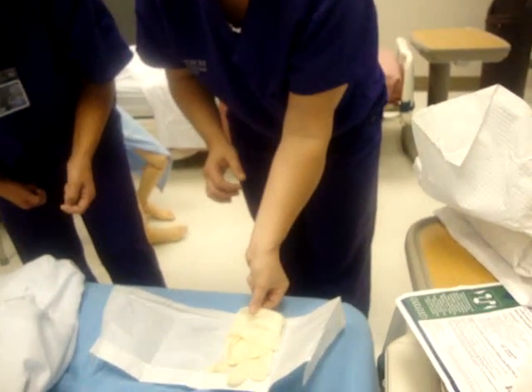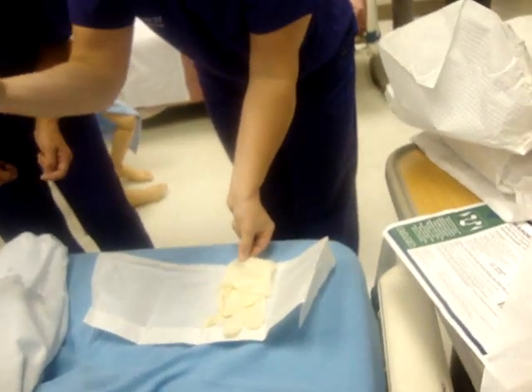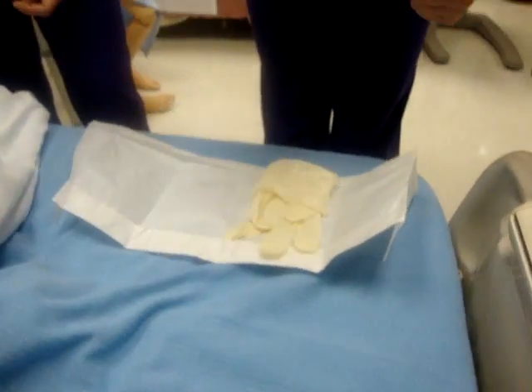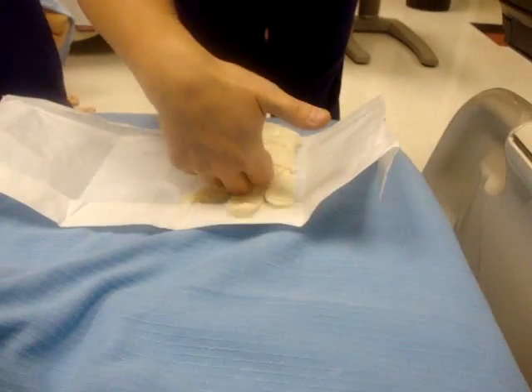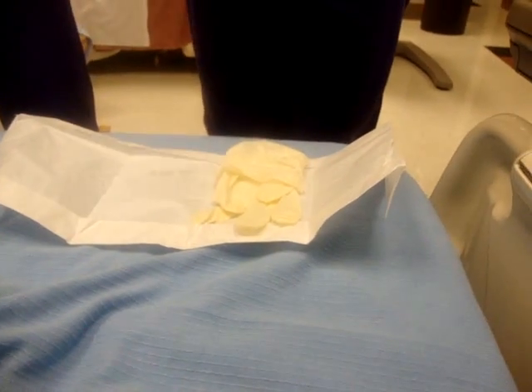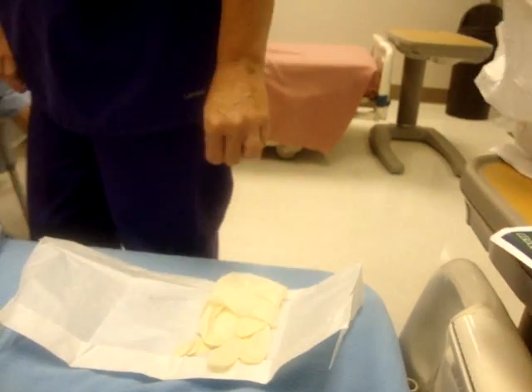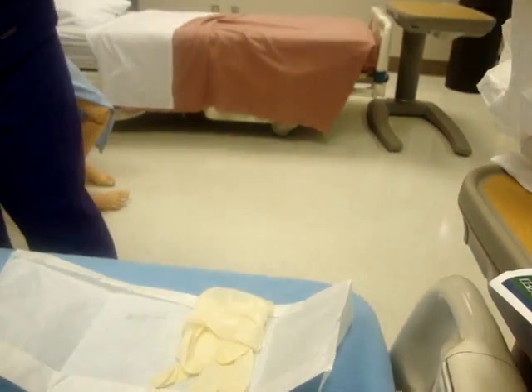This part is going to be against your skin. All right, the second one — now you've got a glove on, you can't touch it down here. You have to reach in this way with your gloved hand, the sterile part, to put the part against your skin. So what does he have on — is that a tattoo? Yeah, I guess he's a gangsta.